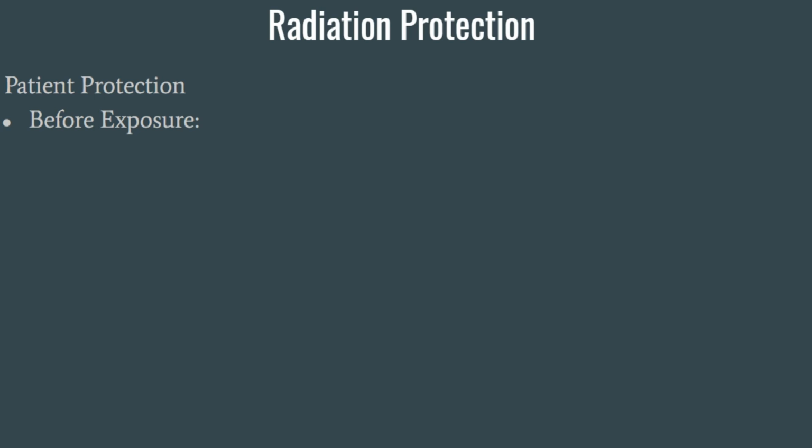You want to make sure that the doctor has prescribed the radiograph. This is something that's usually discussed in the morning meeting, or it's a standard. Your patient comes in every 6 months, they get their cavity detection x-rays taken, or once a year they get those cavity detection x-rays taken. But you need to make sure the doctor is aware that this x-ray is going to be taken. Or rather, the doctor should be the one making you aware that this x-ray is going to be taken.